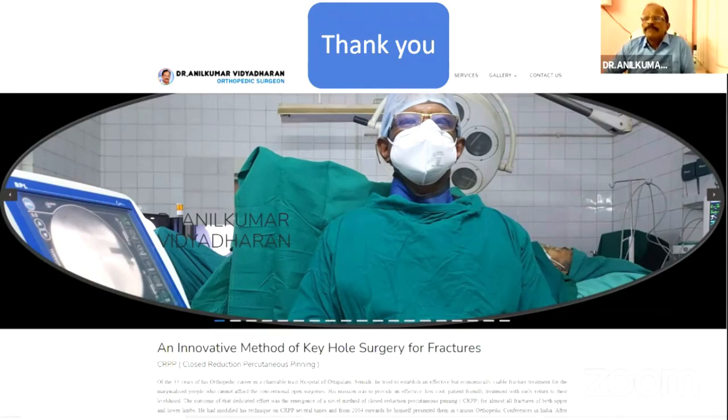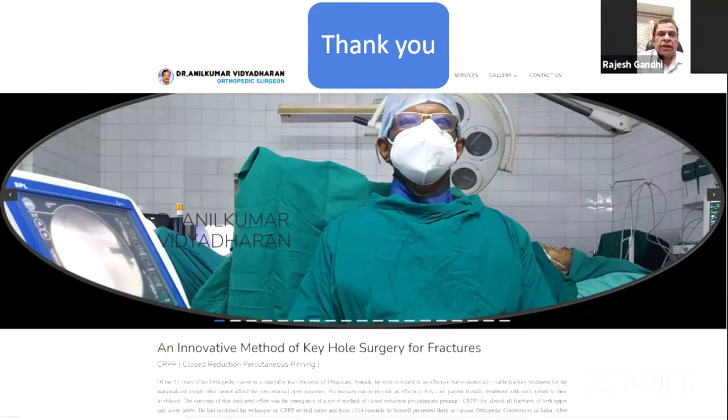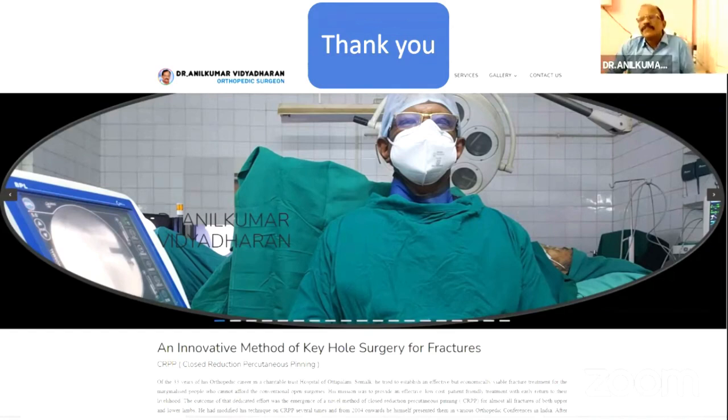I am feeling the penetration of the K-wire through this cortex, medullary cavity, and the opposite cortex from the resistance which I felt in the drill. That's why I am using these smooth K-wires in this case. And another thing is that I have seen your lower radius presentation wherein you use a small mini X-fix for keeping the fixation while you are doing the fixation. Do you use any such device or do you do it freehand? No, sir. It is only freehand.